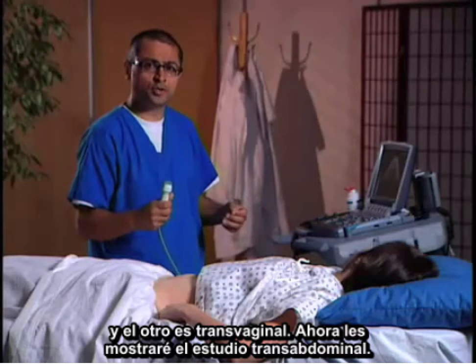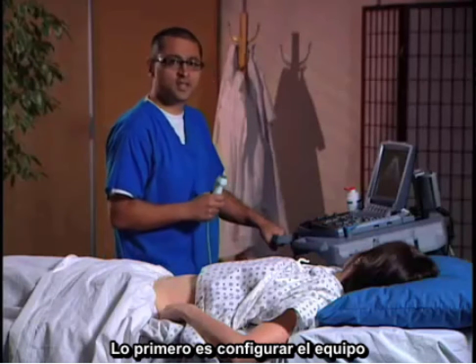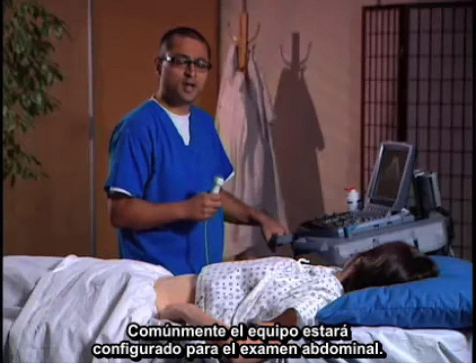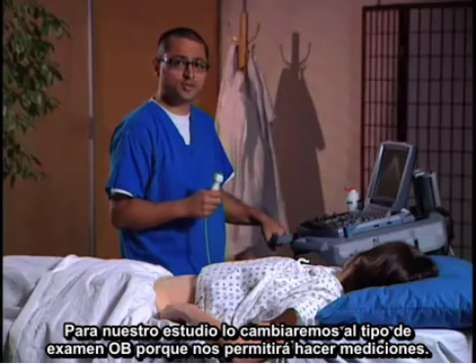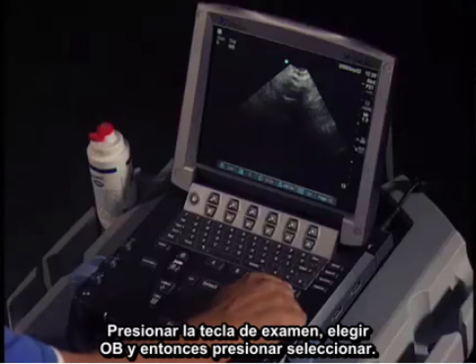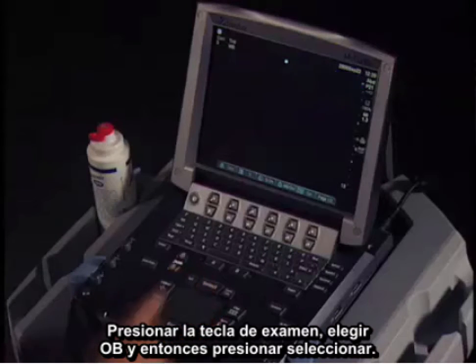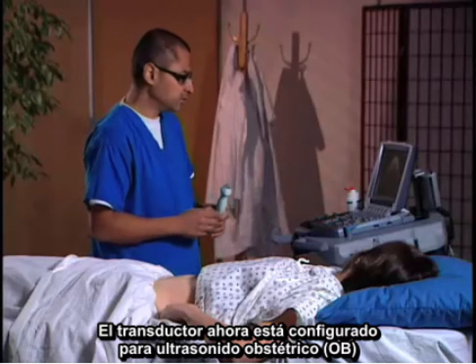Right now I'm going to show you the transabdominal approach. First thing is machine setup. Commonly the machine may have already been set up in an abdominal configuration. I'm going to go ahead and switch to the OB configuration because it allows us to do measurements as well. So I'm going to hit the exam key, click on OB, and then hit select. The transducer is now configured for OB ultrasound.